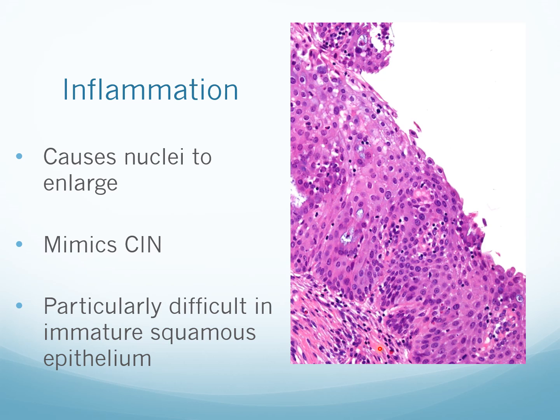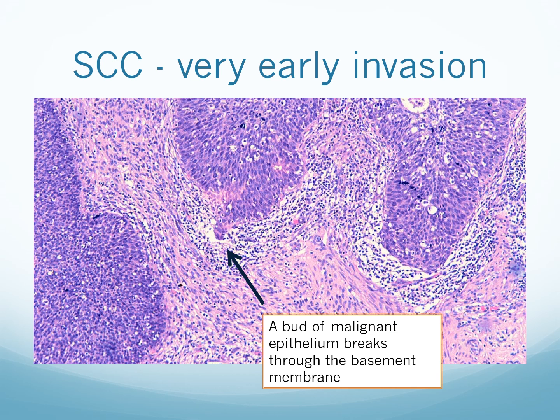This doesn't mean that it is CIN because they lack the irregular nuclear outline, overlapping, and dense packing and hyperchromasia of CIN3. But the lesson here is that not all changes that have these basal type cells extending to the surface are CIN. Cytology is particularly useful in telling the difference between these conditions. Let's have a look now at squamous cell carcinoma.